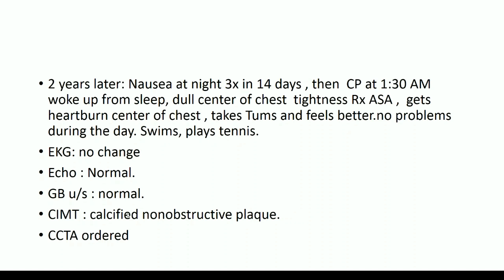EKG showed no change. Echo showed normal. At the same time, we were able to do a gallbladder ultrasound sliding the transducer down. He was NPO, and his gallbladder looked great. And CIMT showed some calcified non-obstructive plaque, and we ordered a coronary CTA, and he said at this time that he would have the test done. So we did it. So I'm going to show you that.